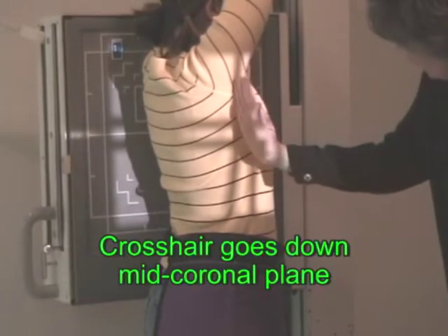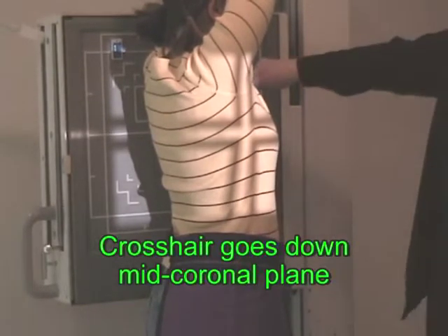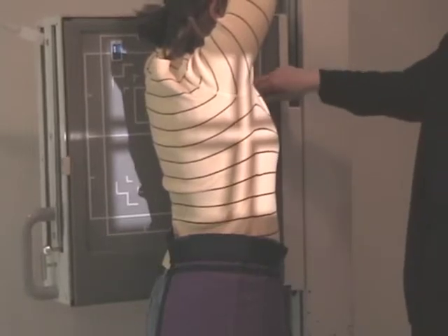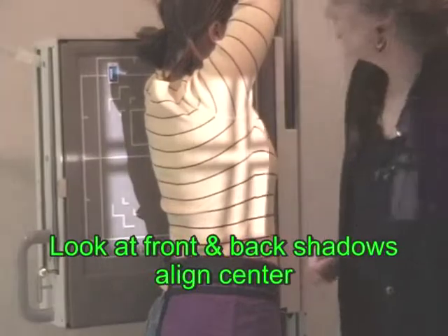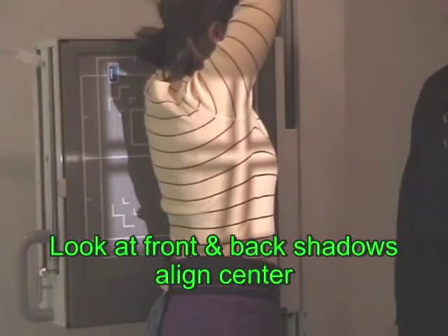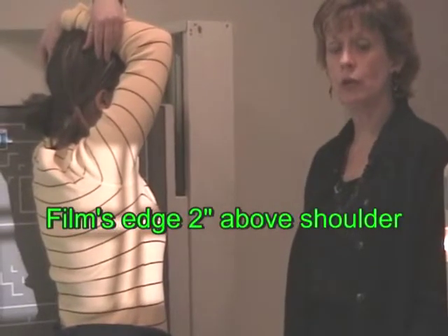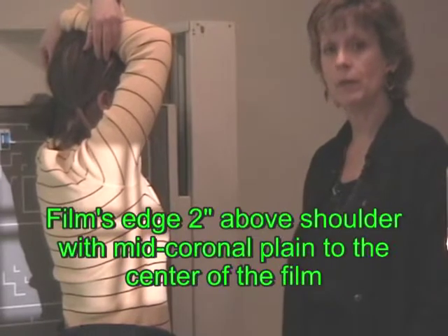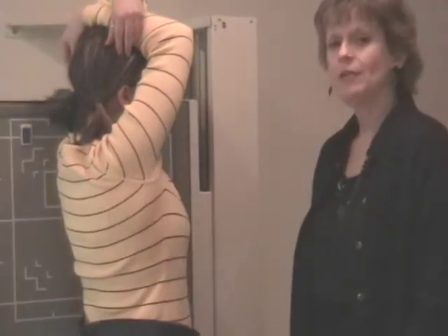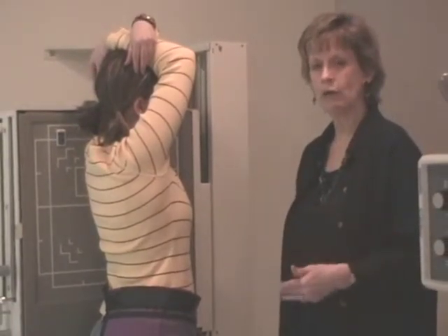And then this cross here is going to come right down the mid-coronal plane. I look at the front shadows on the wall bucky, and I look at the back shadows on the wall bucky. That helps me centering. Again, the part film reference points. Film's edge 2 inches above the shoulder with the mid-coronal plane to the center of the film. Now I need to make the anatomy look like it's a true lateral position.